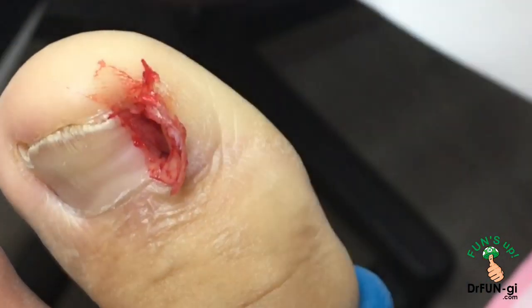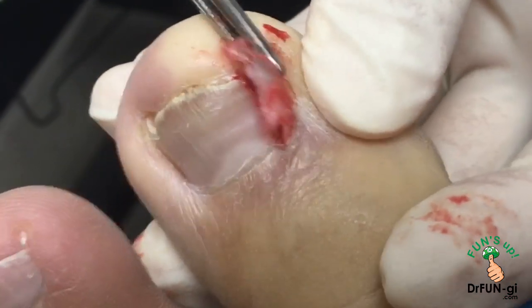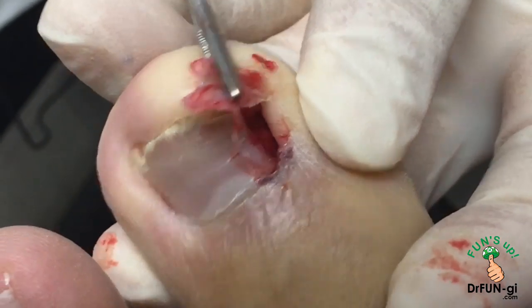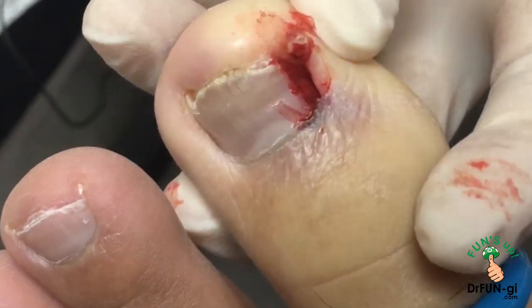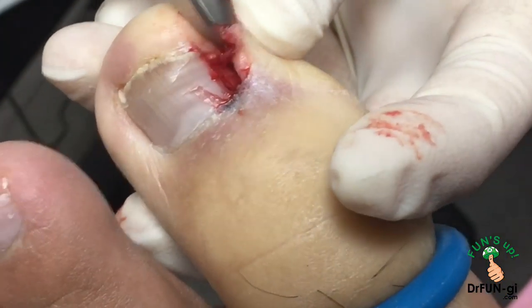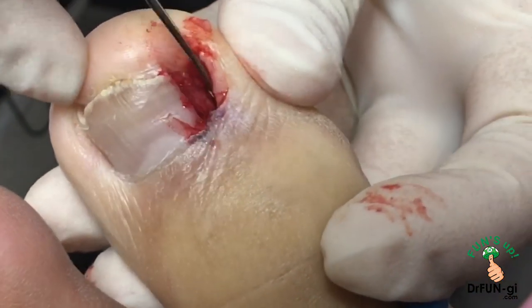That's the nail right there, and then there's a big piece of skin also. You want to make sure that this drains properly because it's going to be draining from here, so we need to remove all the skin around this so that it properly drains. Then I'm going to make sure that this is nicely all cleaned up — which it is.